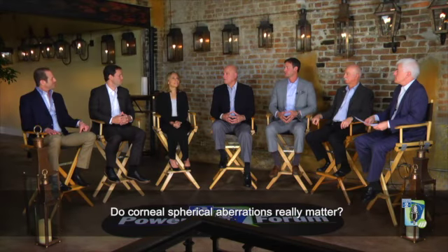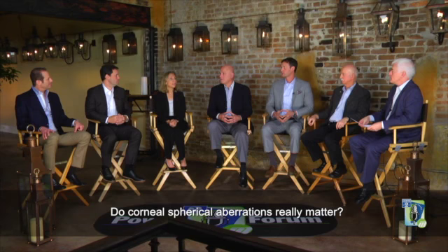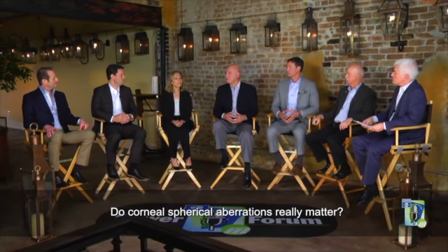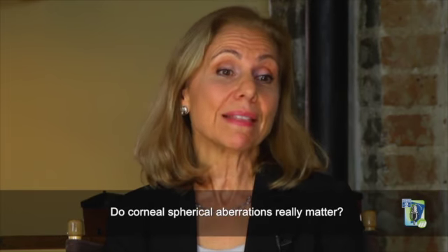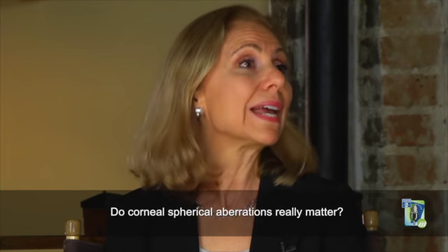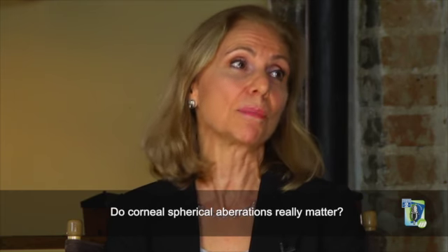I use the spherical aberration number for patients who select monofocal implants because I want to help them as well reach the best potential vision that they can achieve. So for those who select monofocal IOLs, I try to match, like Toby and Mitch said, the best possible spherical aberration lens based on their corneal numbers. So that is something that therefore helps them get better vision, especially at night or in dusk. In low contrast sensitivities, it enhances their contrast vision.